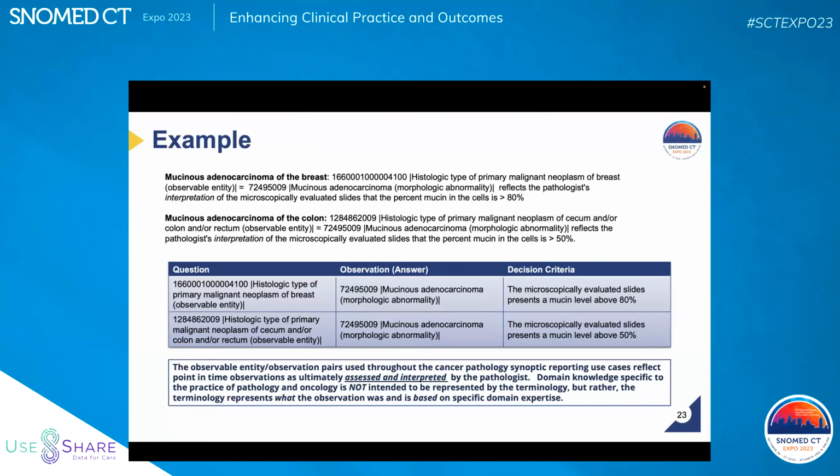And actually, that is the example. What the pathologists assess and interpret is the answer. So we can make a big argument about what an ER positive tumor is. We would have discussions like this, and the pathologists would say, you can't just say it's positive, it's how many percent of cells, what monoclonal antibody you used, and was it strongly there. That's your business. But you ask the question, is it either positive or not?